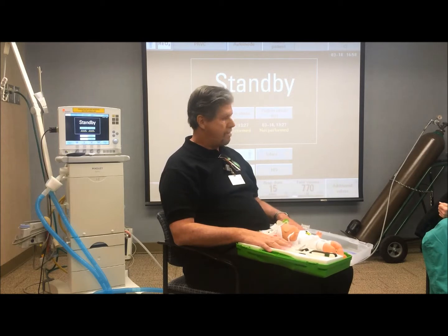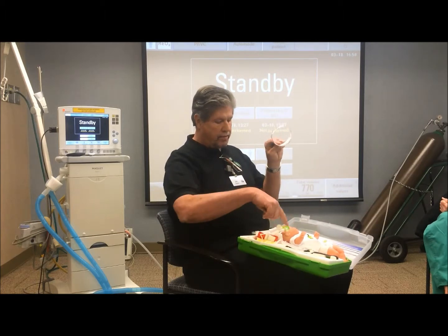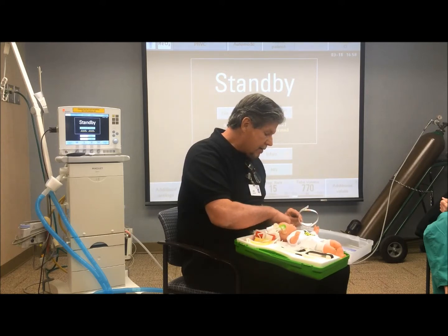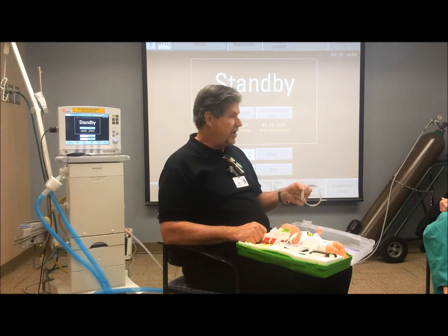So is the tape measure as in with the mini flow? Yeah. Okay, gotcha. It comes with the tubing thing. The generator, okay. That's what I wanted to make sure. Yeah. So that's what it comes with. And then you do your measurement.